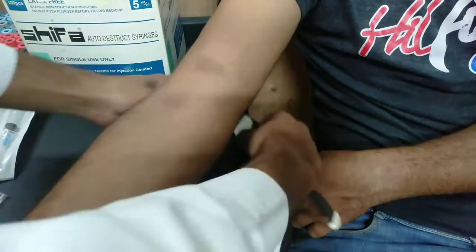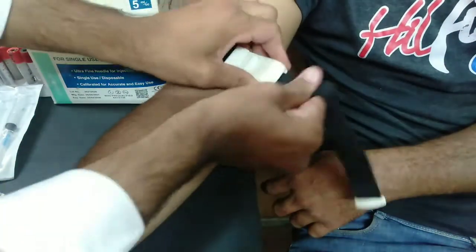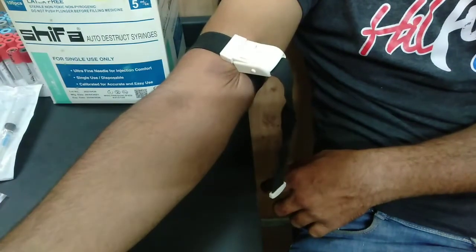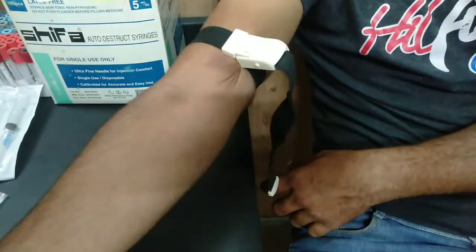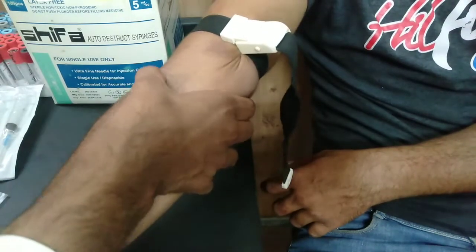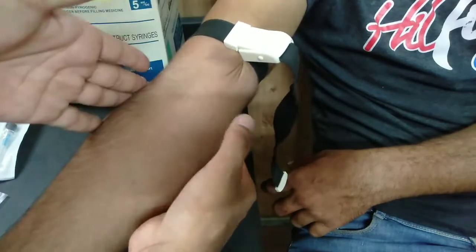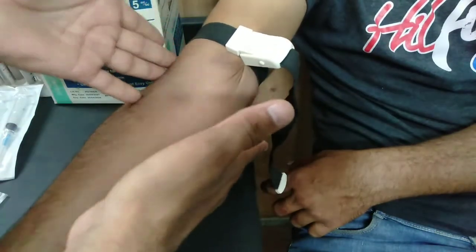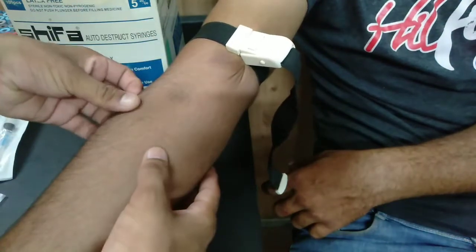Firstly we apply the tourniquet on the patient's arm. Then we detect the veins. This is the right side of the patient's arm and left side of the vessel. This is the median cubital vein.